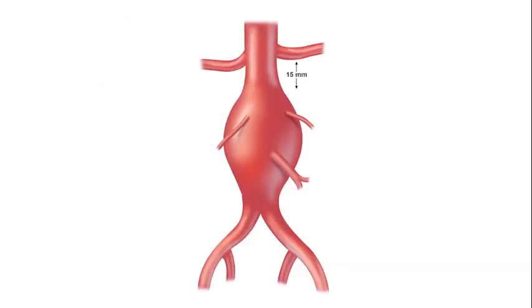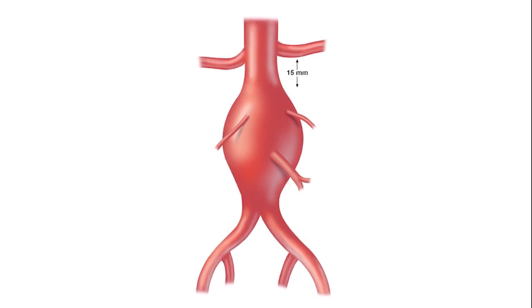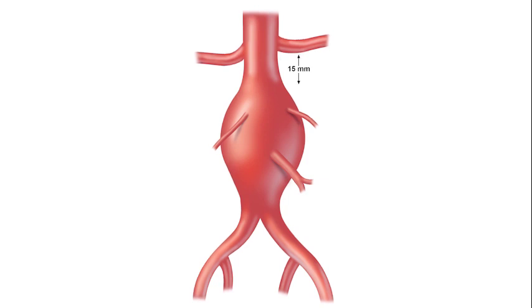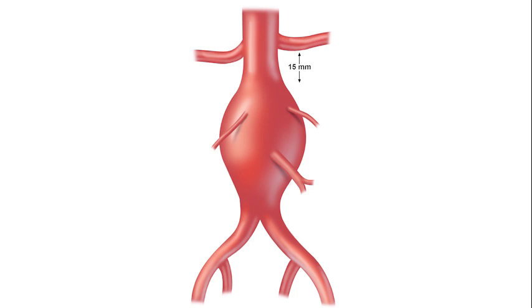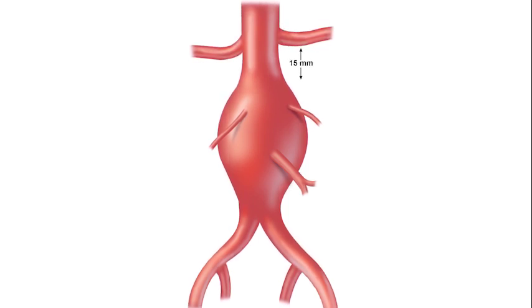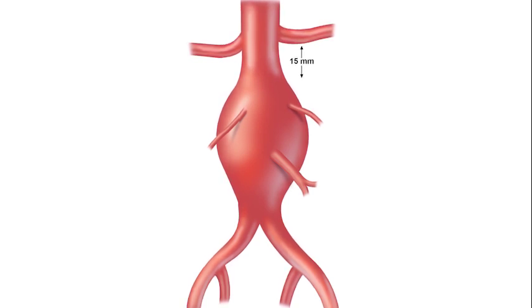The anatomy of the aneurysm neck is the primary factor that determines whether EVAR is the appropriate treatment. Aneurysms with a minimum neck length of 15 mm, angulated no greater than 60 degrees, and cylindrical neck that is not irregularly shaped are the most suitable for endovascular repair. Aneurysms with a neck that lacks one of the ideal features may still be treated successfully with EVAR, but the more issues there are with neck anatomy, the lower the likelihood of treatment success.